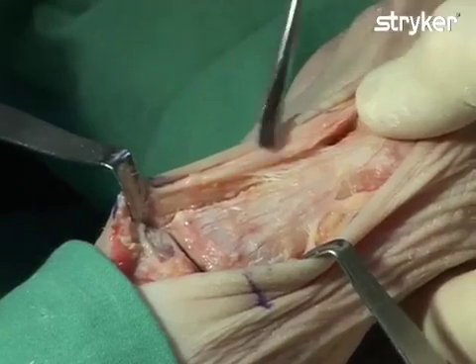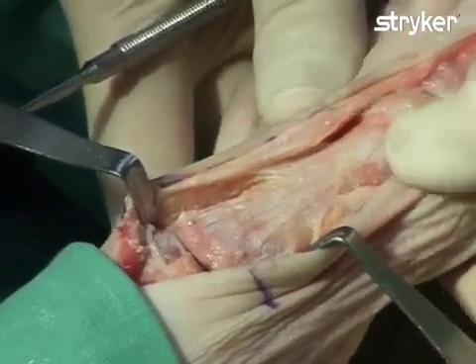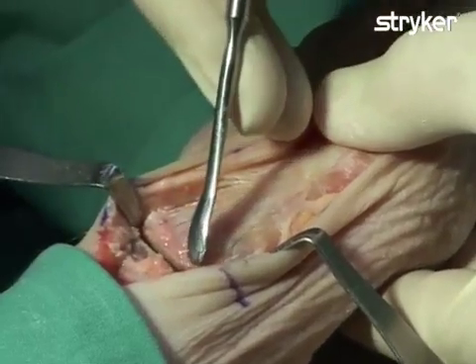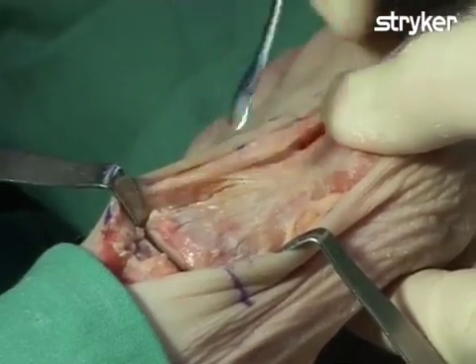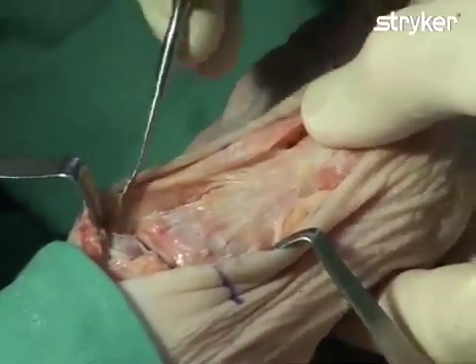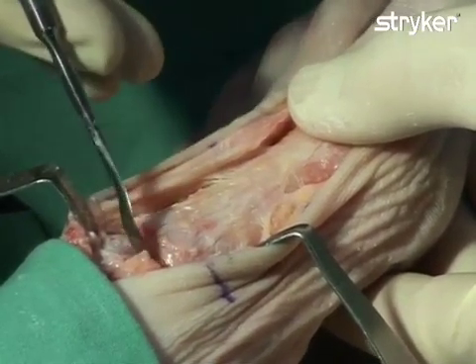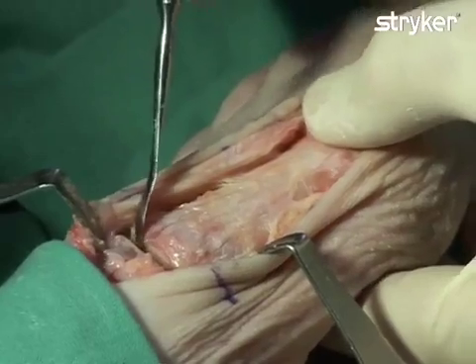The primary goal of the planned correction is to reduce the intermetatarsal angle. Therefore, we must shift and re-angulate the first metatarsal to normalize the intermetatarsal angle. We will first remove the cartilage from the first metatarsal, perpendicular to the long axis. We will then remove a small wedge from the medial cuneiform with an approximate thickness of only 2 mm. The base of the wedge will be lateral, and the cut should be perpendicular to the long axis of the second metatarsal. It is very important not to take too much bone, as this will create excessive shortening of the first ray.